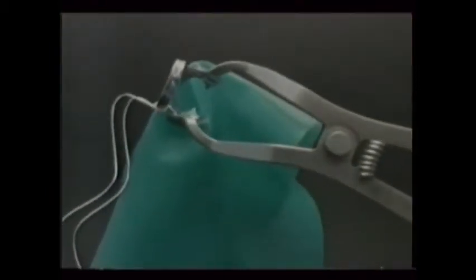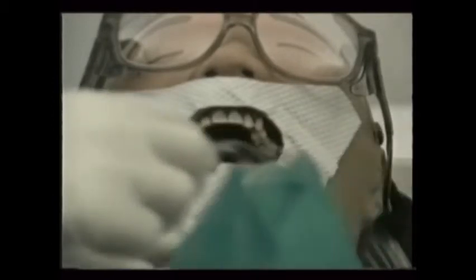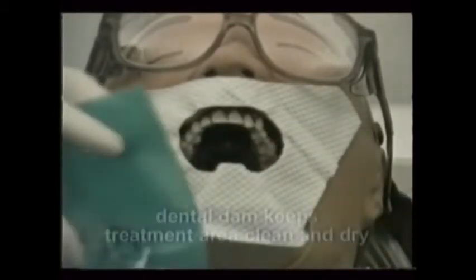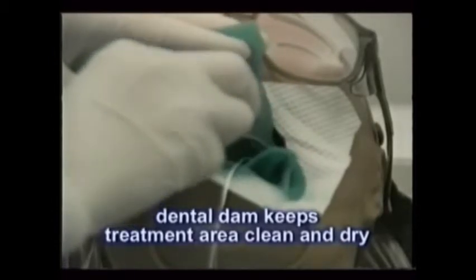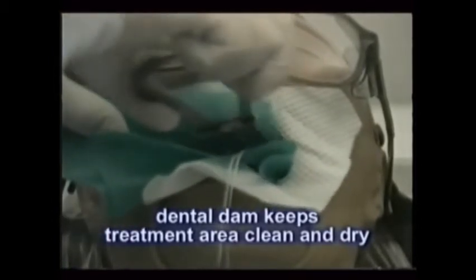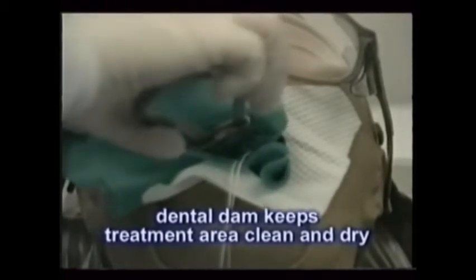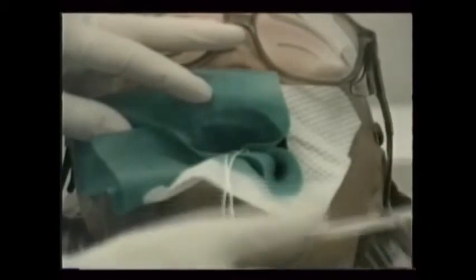After the anesthetic is administered, a rubber dam may be used. Its placement is explained in detail in the film on endodontics or root canal therapy. The rubber dental dam is often needed to help keep the teeth clean and dry when bonding and placing composites in critical areas, especially in the back teeth. Its use greatly improves the chance of getting a satisfactory bond, which is so important in retaining the filling.